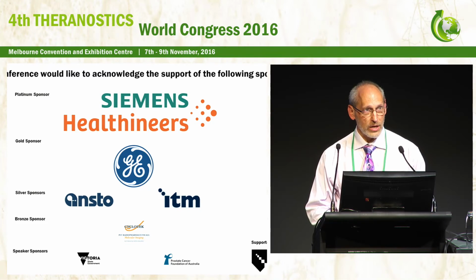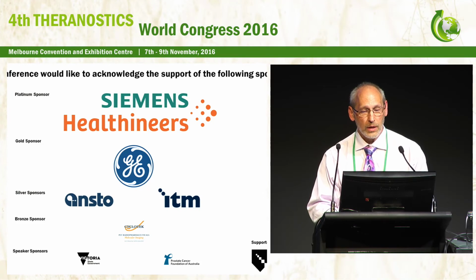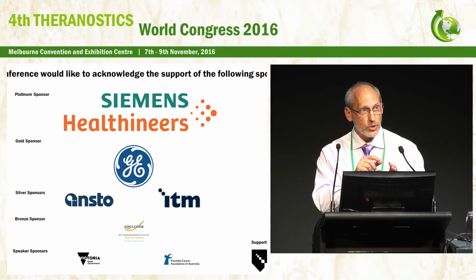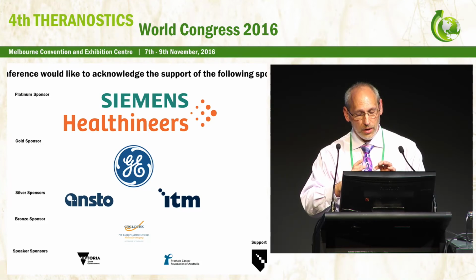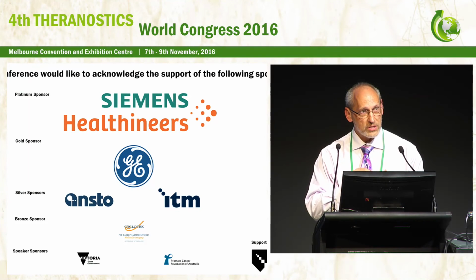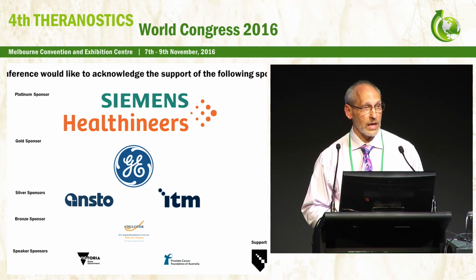You don't want to measure the stuff that's in the collecting system, and when one does do the expansion of that volume of interest of the kidney, first, for the kidney volume itself, we avoid the collecting system, number one. Then we expand that by 1 centimeter, but then in particular, if we see there is activity in the collection system, then we do modify that volume of interest to avoid where the urine happens to be, because that does impact it quite substantially.